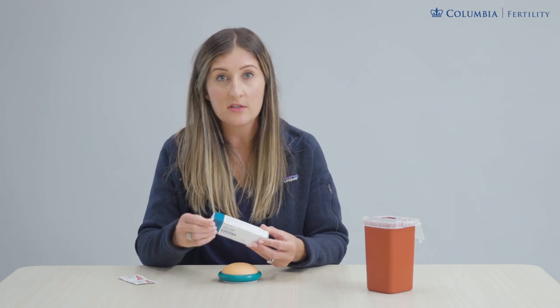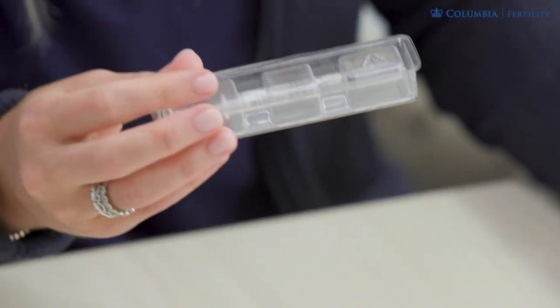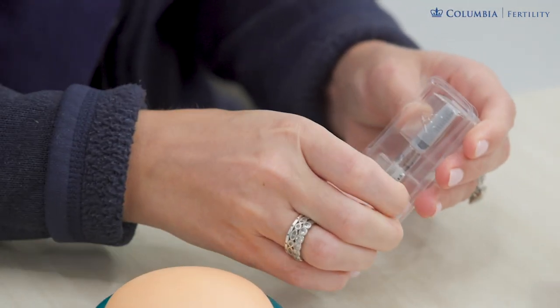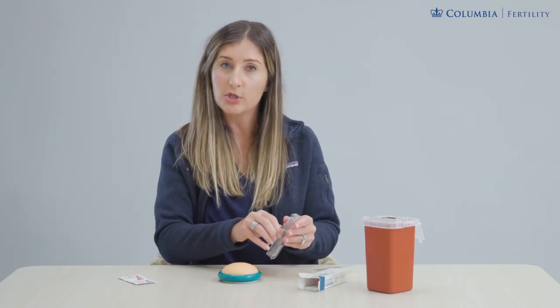This is going to be a pre-filled syringe of medicine and it's a standard dose, so each box is one night's dose. When you open this up you'll see a pre-filled needle with a standard dose of medicine, and the most that you might need to do here is push out an air bubble.